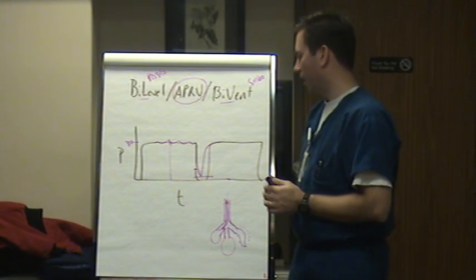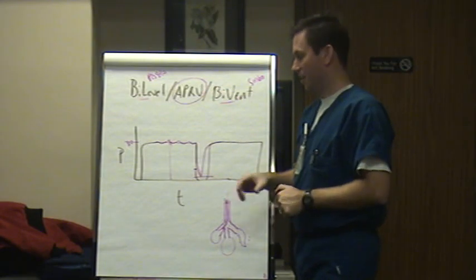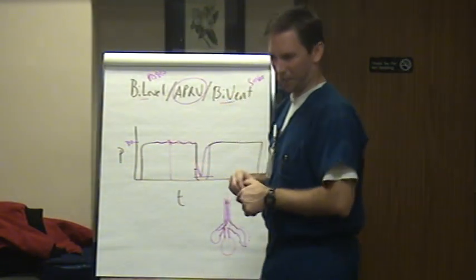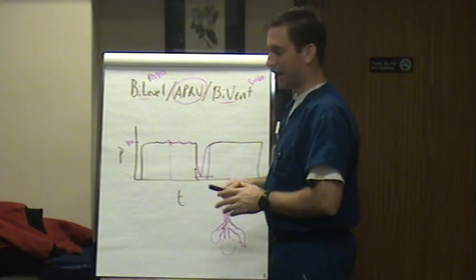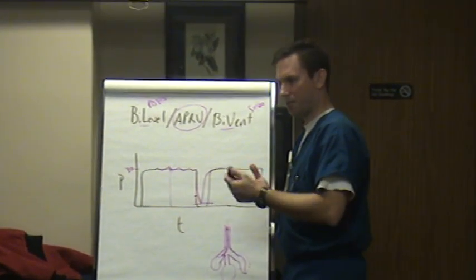I'm not going to necessarily agree on comfortable, but they're not fighting it. They will breathe over. They still have to be heavily sedated because it's like me taking you and putting you on 30 a PEEP, and then you trying to breathe. You know how I was doing a minute ago. So I don't want to remember that. So I probably need to be sedated. But it does allow me to breathe and allows the patient, because they're breathing, to control their CO2. And from slide number 1, what's a good thing about them spontaneously breathing?